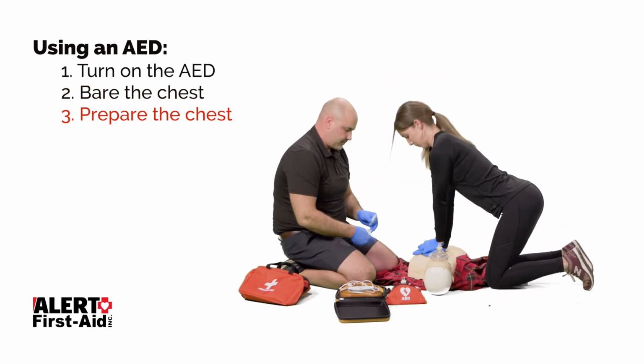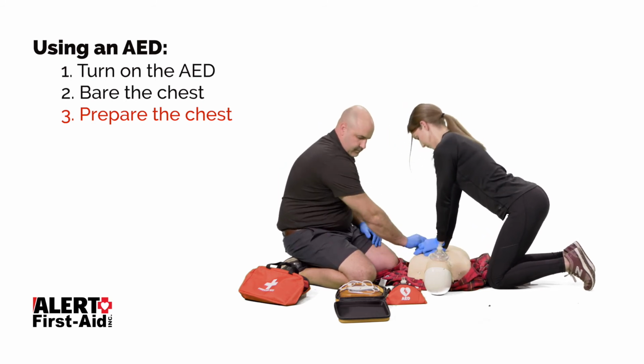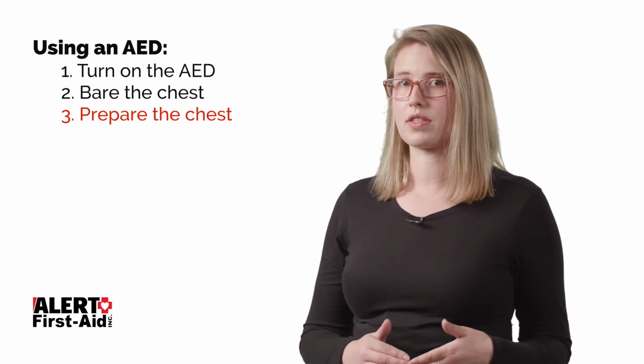Next, prepare the chest. Pads stick best to clean, dry skin. If the person has a very hairy chest, this could interfere, so there's a prep razor included in the AED packages so you can shave them quickly. Remember, time is key and it doesn't have to be perfectly shaven. Most people in cardiac arrest will be sweaty. There should also be an absorbent cloth in the package to wipe them dry.